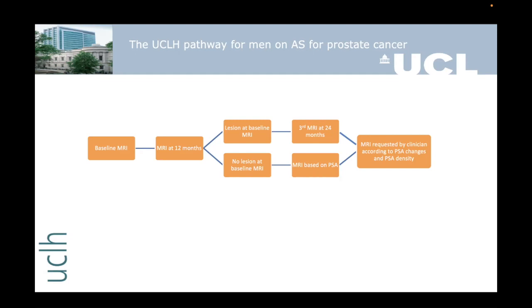Yeah. No, that makes a lot of sense to me. I'm just wondering whether even with a lesion at baseline, I'm just reflecting on my practice. I think unless there was a significant change in PSA, I'm not sure I would go ahead with further MRIs. Declan, how about you? What's your perspective on that?